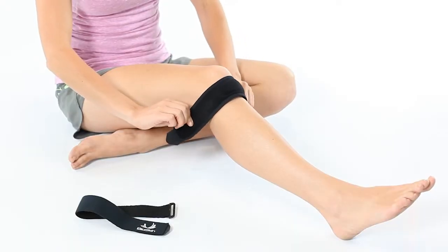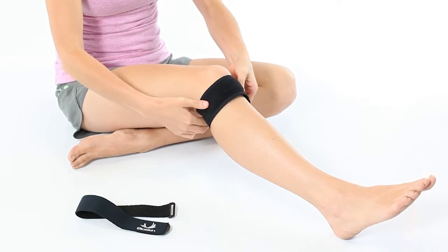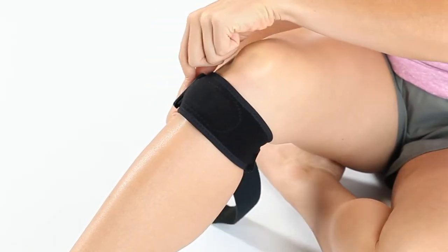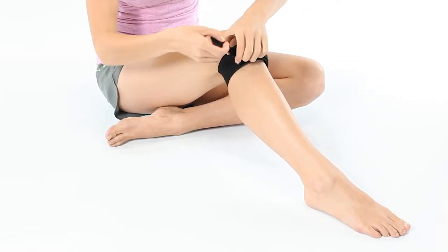Next, wrap the strap around your leg and attach behind the knee. Finish by attaching the Velcro tab near the D-ring to the outside of your knee. Then, wrap the strap around the back of your leg through the D-ring, tighten and attach.